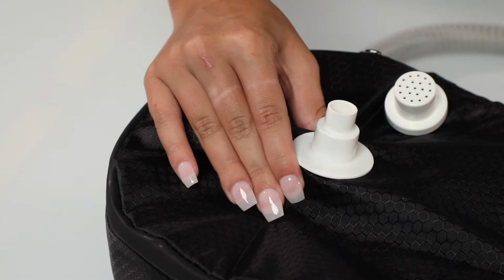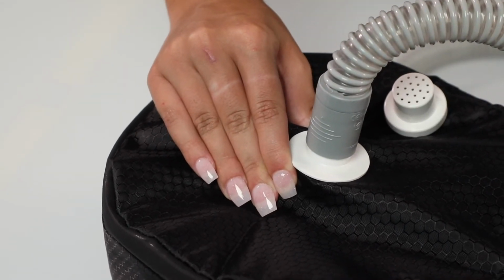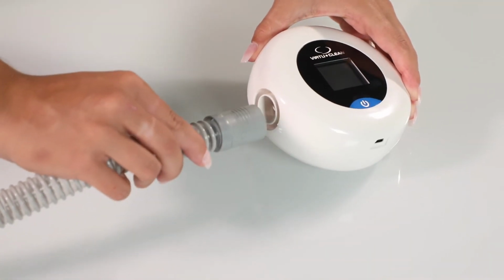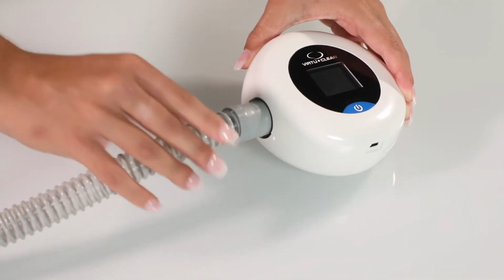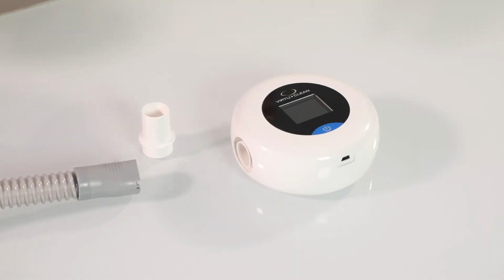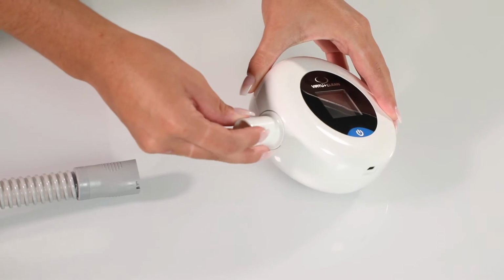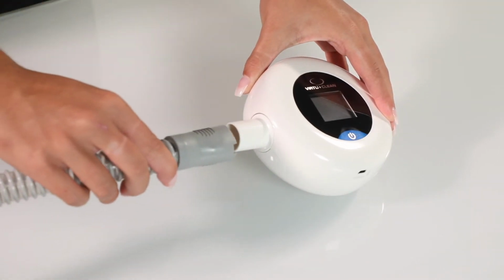Next, connect one end of your CPAP tubing to the attachment located at the top center of the bag. The other end of the tubing will connect to the side of the VirtuClean device. If you have a heated CPAP tube, first insert the provided adapter into the VirtuClean device as shown, and then connect the tubing. Your VirtuClean is now ready for use.